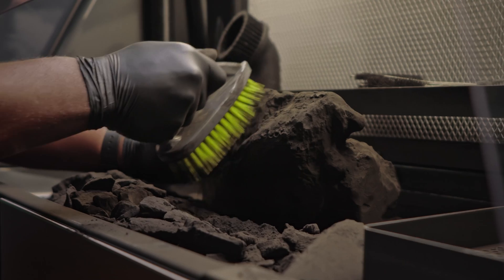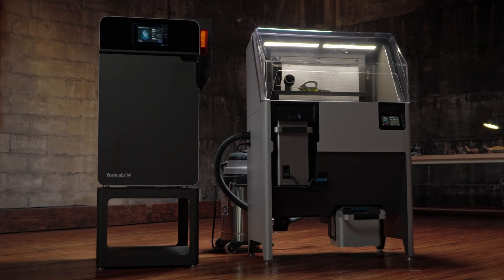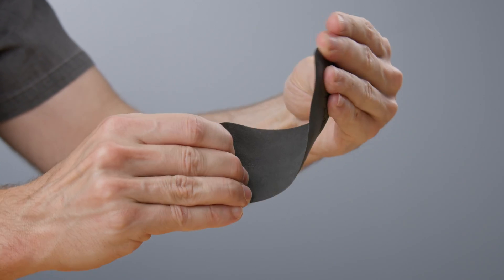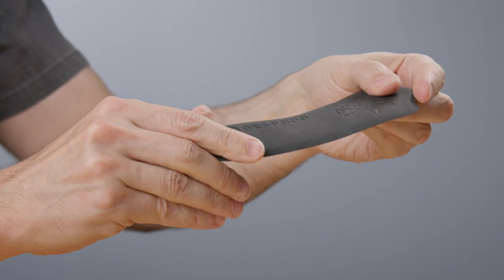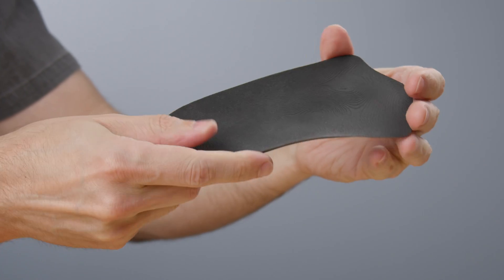Equipped with a compact powder recovery system and a nitrogen atmosphere for advanced performance, the Fuse 1 Plus 30 Watt is easy to use, maintain, and build your business on. Developed and validated on our printers, Formlabs Nylon 11 Powder is perfect for printing insole shells with high ductility and long-term stability.